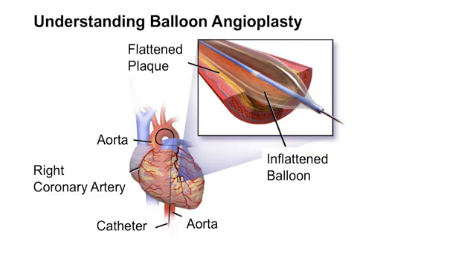We now require this small coronary guide wire, which is quite thin, 0.014 inch. We go through the coronary arteries, we wiggle a little bit, we pass through the stenosis, and we go down deep into the coronary arteries. We still require the balloon, which is not unlike that used by Dr. Grüntzig in 1977. We follow up over the wire, we go into the coronary arteries, we place the balloon in the stenosis, and what we have to do now is pump it up and open the stenosis.